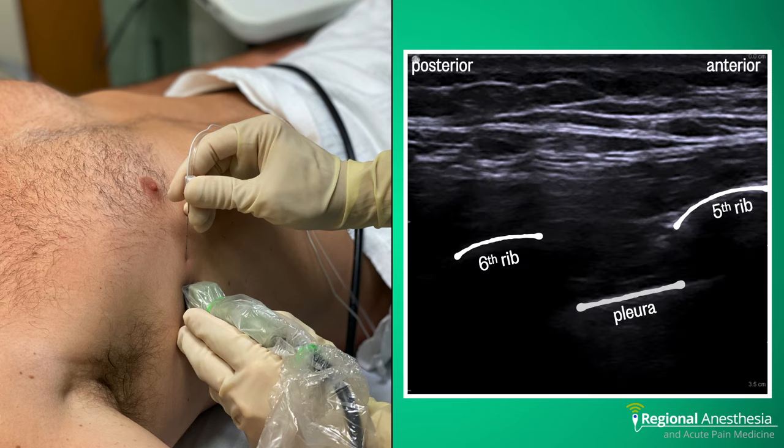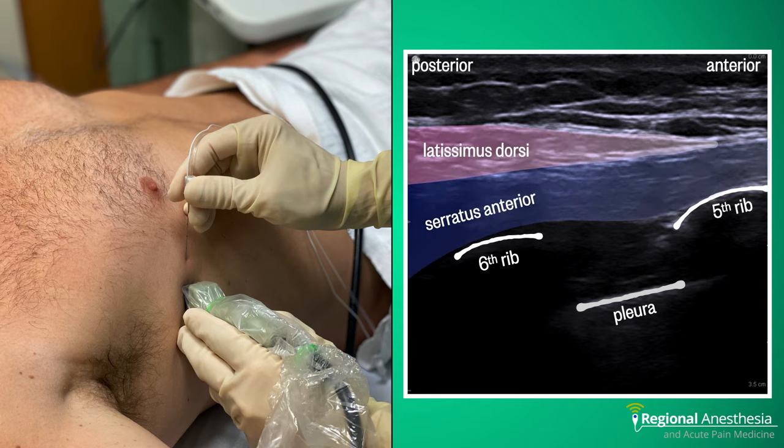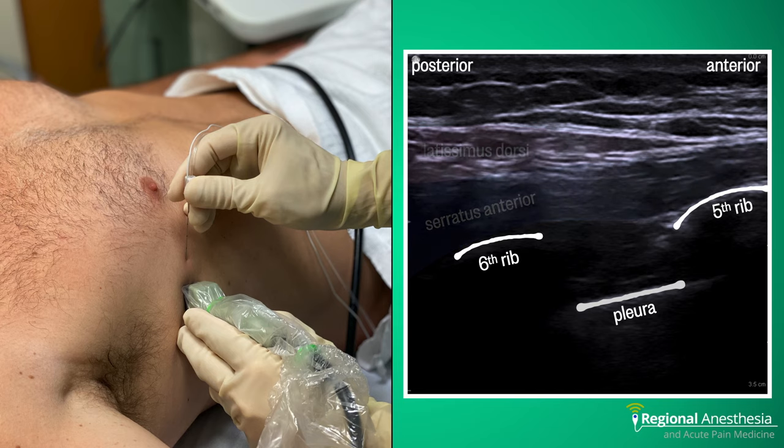Here's a typical sonogram for starting the serratus plane block. You should see the fifth and sixth ribs with the pleura sliding underneath. Immediately over the ribs, we find the serratus anterior muscle. Superficial to that is a wedge of latissimus dorsi. If you don't see the latissimus right off the bat, you probably aren't posterior enough — just translate your probe towards the bed and latissimus should come into view.